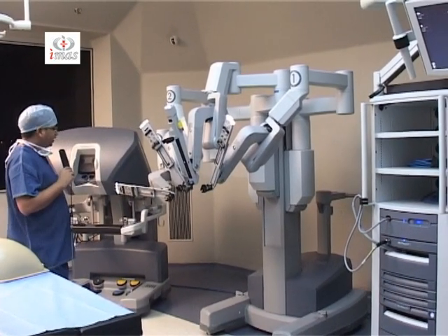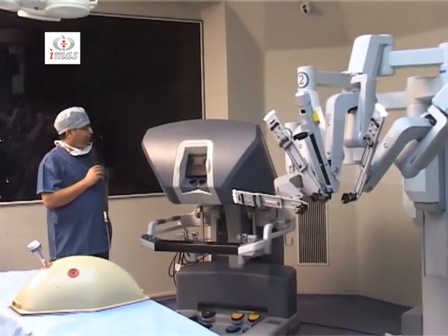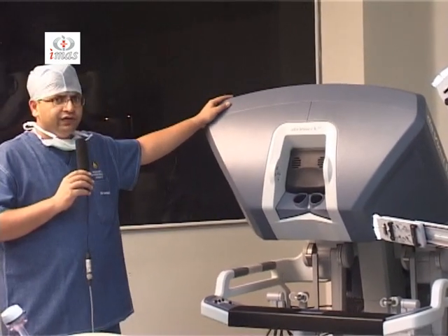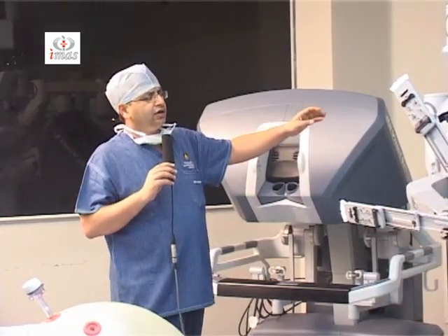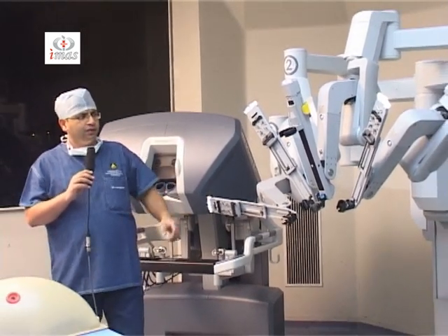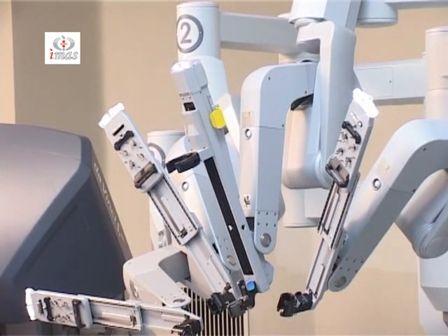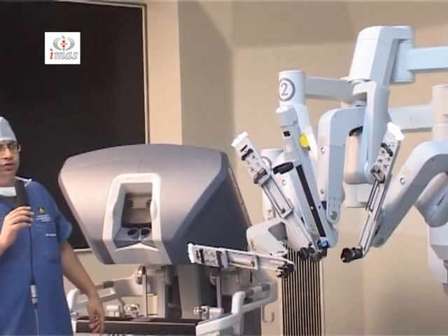This instrument you can see here is the latest Da Vinci SI High Definition Surgical System, commonly known as surgical robot. It has three parts. The first one is the master console, where the surgeon sits and controls the movements. Then comes the patient cart, which is a four-arm patient cart in which there is one camera arm and three instrument arms, on which the instruments are mounted and they are controlled using the master controls on the master console.